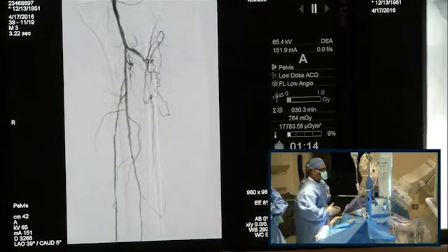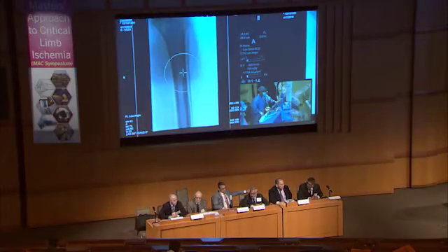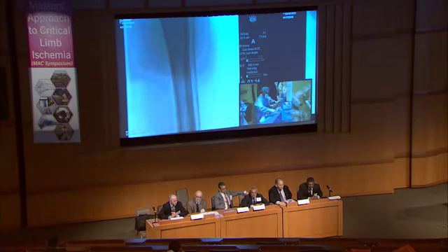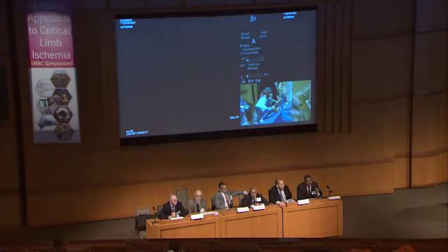I think I would go with John's suggestion that before you go for the AT, you have two vessel runoff. I would really optimize the SFA stent. I think it is really very crucial because if you leave it with residual disease, the whole idea of producing outflow will not be sufficient. No, you have to fix the outflow now, and then you can finish with the SFA. So clearly, you need to optimize the posterior tibial, and the next step would be to open the anterior. And then you have really unrestricted outflow through all three vessels, and that's the perfect condition to finish with the SFA. So we have two different suggestions.